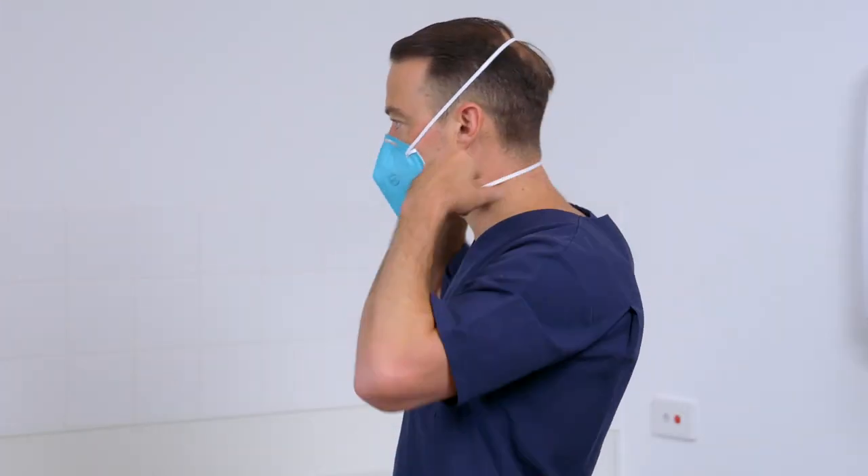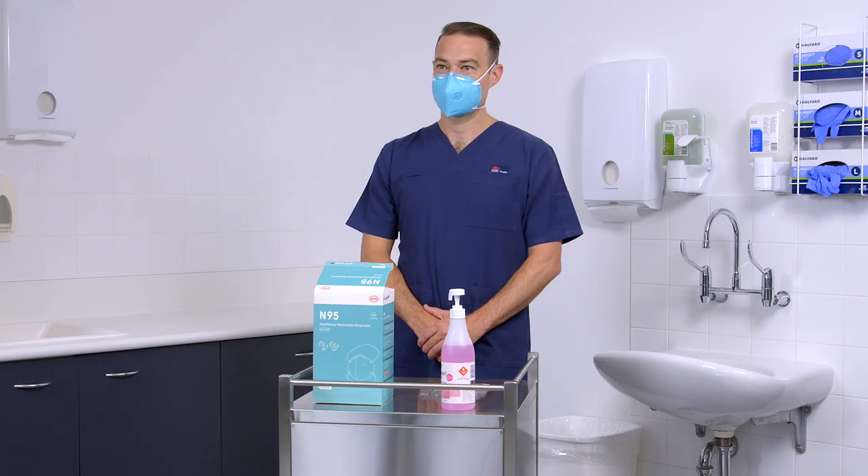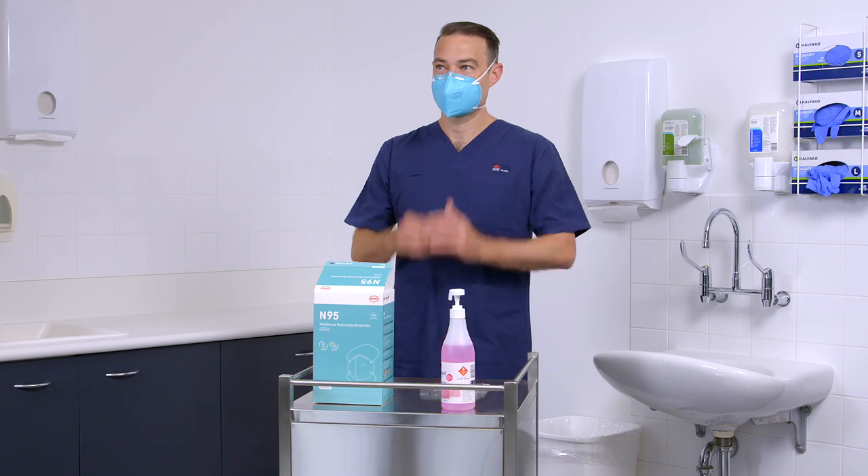This type of respirator requires close attention to the process of fit checking. To fit check an N95 foldable respirator, place both hands over the respirator, taking care not to disturb its fit. Gently place hands around the edge to feel any air escaping when the fit check is assessed. Take a deep breath and hold your breath for a few seconds, making sure the respirator collapses inward as you inhale. Then exhale, making sure your respirator bulges outward as you exhale.